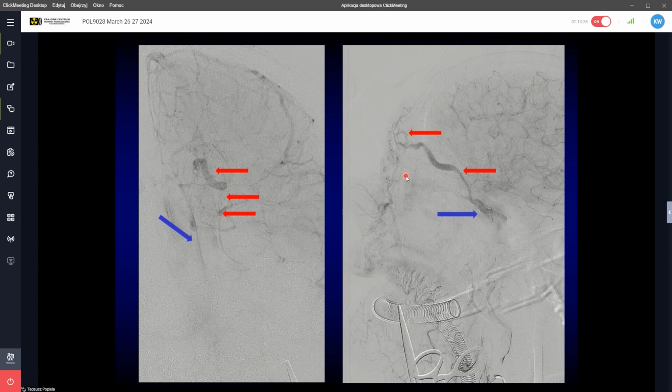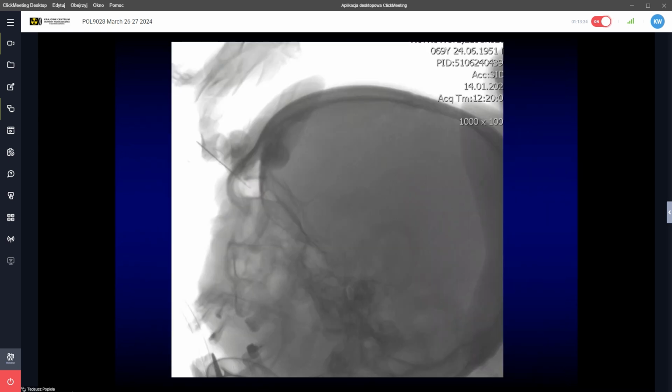So we decided to ask maxillofacial surgeons for help and go through the ophthalmic veins. So they dissect for us the upper part of the orbital cavity. You can see the needle here. This is our hand, and so again, with the help of the surgeons, we can puncture and then catheterize the cavernous sinus directly through the ophthalmic vein.